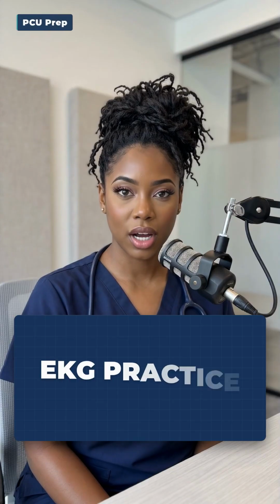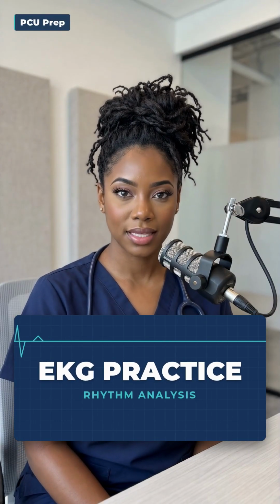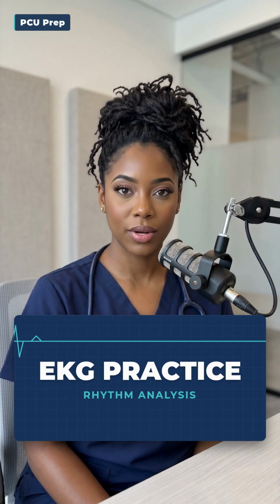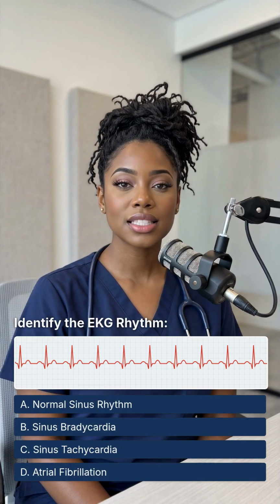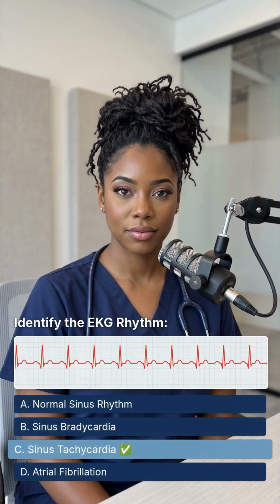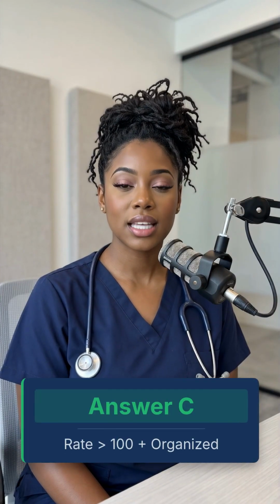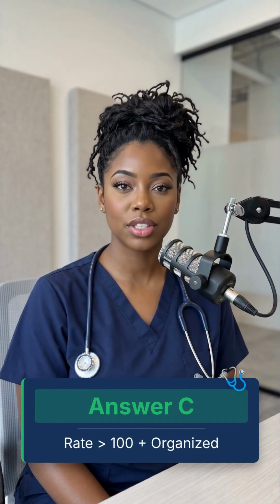Alright, let's test your knowledge. You see a rhythm with a rate of 110, regular spacing, and a P wave before every QRS. What is this? A. Normal sinus rhythm. B. Sinus bradycardia. C. Sinus tachycardia. D. Atrial fibrillation. Check the spacing carefully. The answer is C. Sinus tachycardia, because the rhythm is organized, just faster than normal.